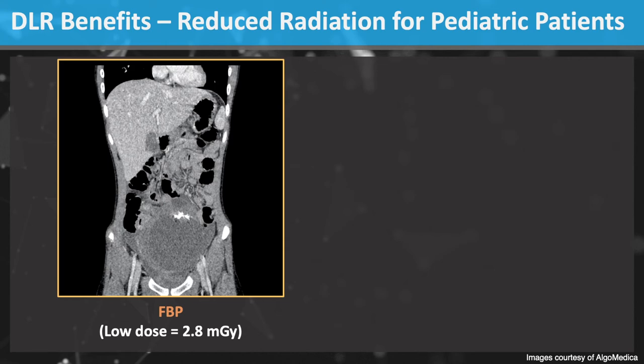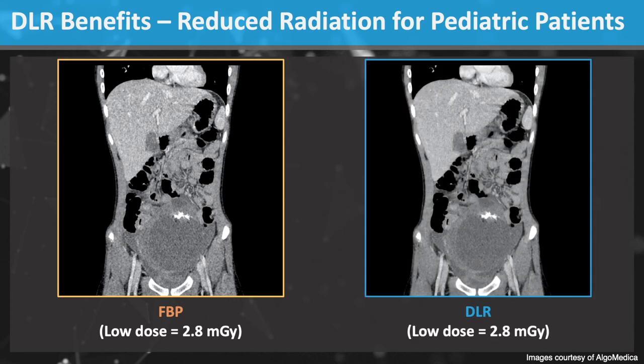Radiation dose is most important in screening exams and in pediatric patients. This pediatric patient had a low radiation dose scan. The images on the left are noisy and of low quality. After DLR, the same image acquisition has reduced image noise and improved image quality. Look at the liver, for example, and notice the reduced image noise.